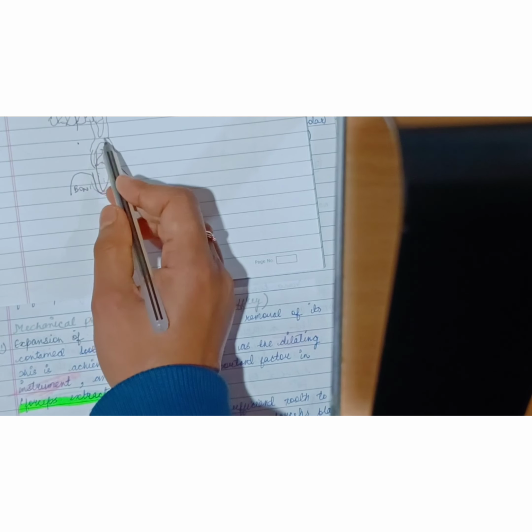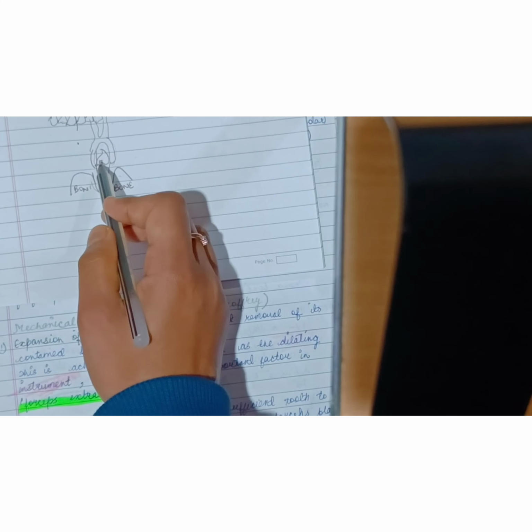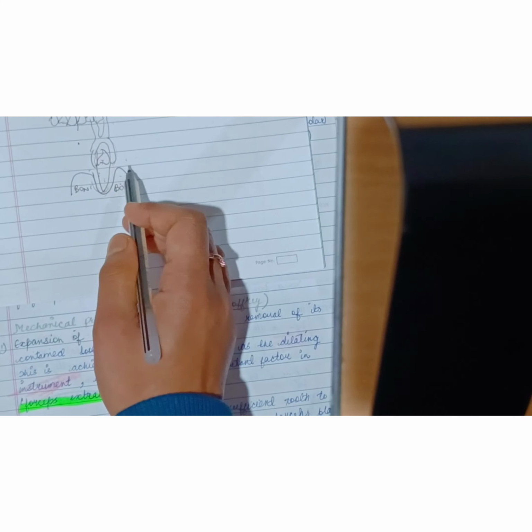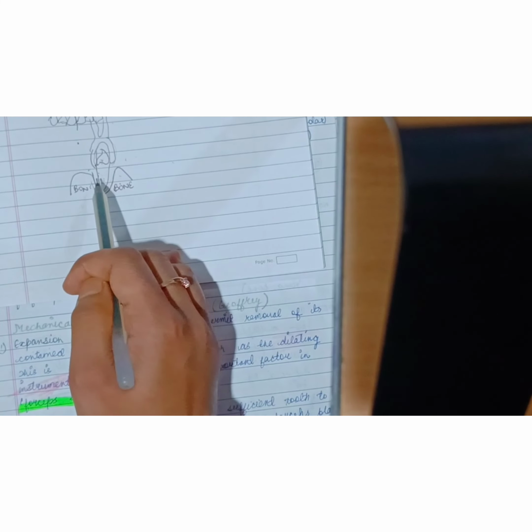So we will hold the tooth with the help of forceps and we will try to dilate the socket by using the tooth as a dilating instrument. So what will it facilitate? It will facilitate the removal of the tooth from the socket.